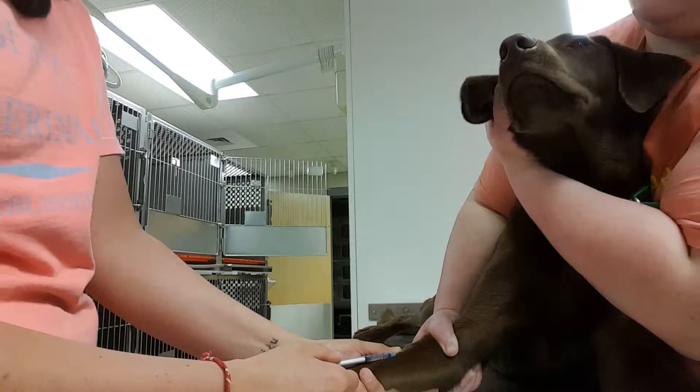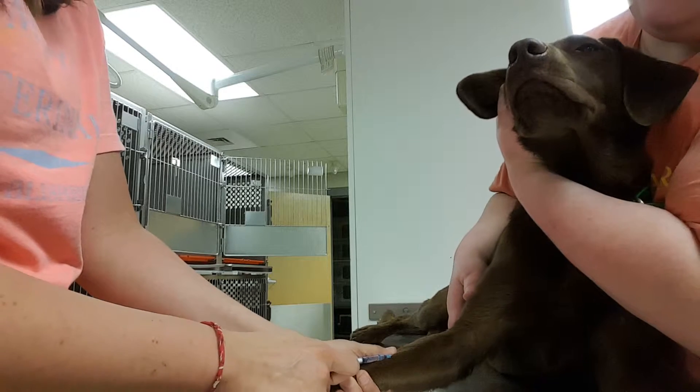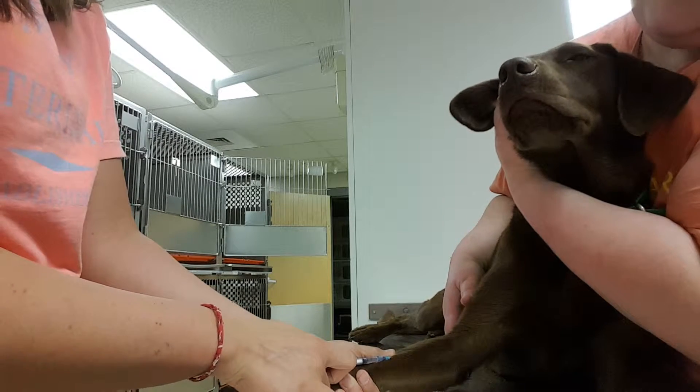Alright, now we see our flash of blood, which tells us we're in the vein. So if my restrainer will let go, I'll slowly inject this medication into the vein.